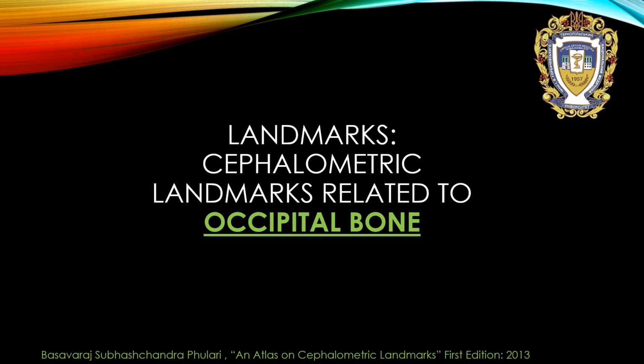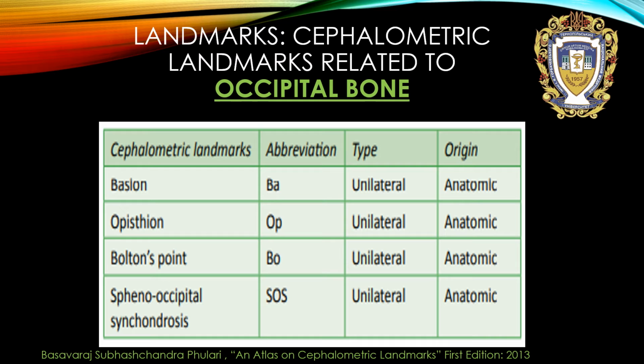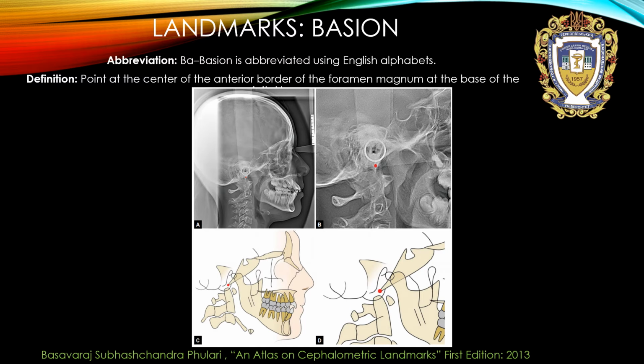Landmarks related to occipital bone. There are only 4 points, and the most important is basion point. It is the point at the center of the anterior border of the foramen magnum, at the base of the occipital bone.